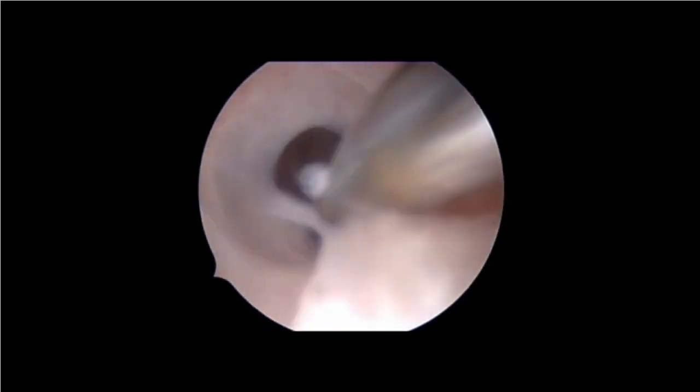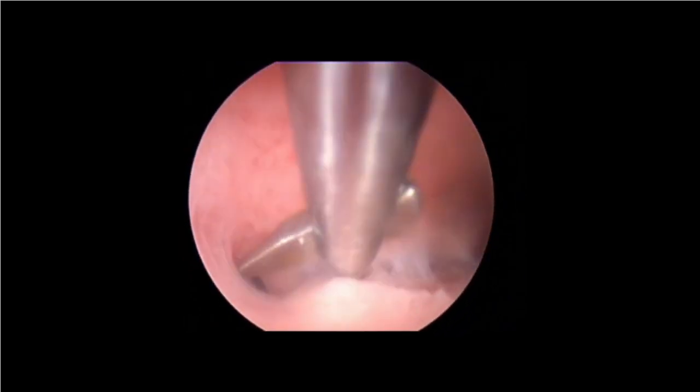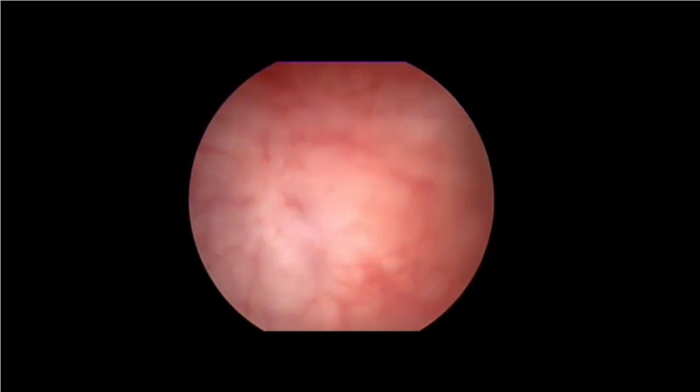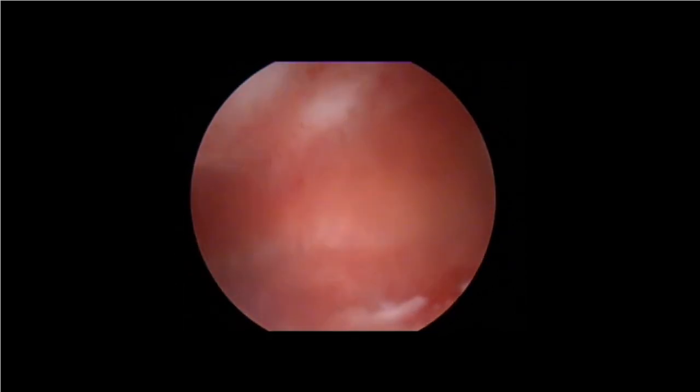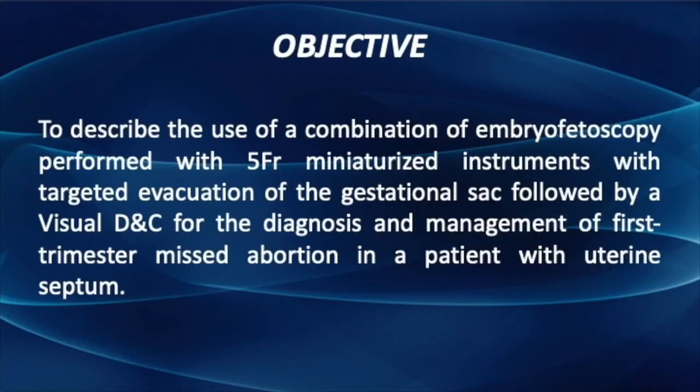We then performed adhesiolysis until complete visualization of the uterine cavity and bilateral tubal ostium was achieved. The objective of this video article is to describe the use of a combination of embryofetoscopy performed with 5 French miniaturized instruments with targeted evacuation of the gestational sac, followed by visual D&C for the diagnosis and management of first-trimester missed abortion in a patient with uterine septum.